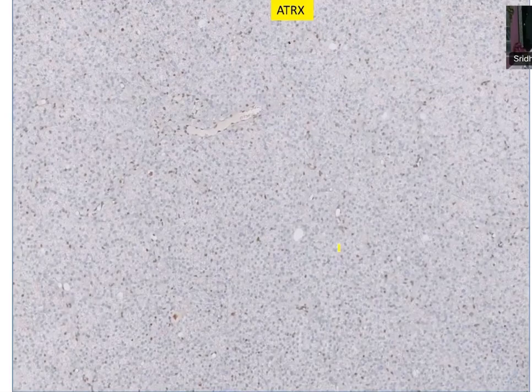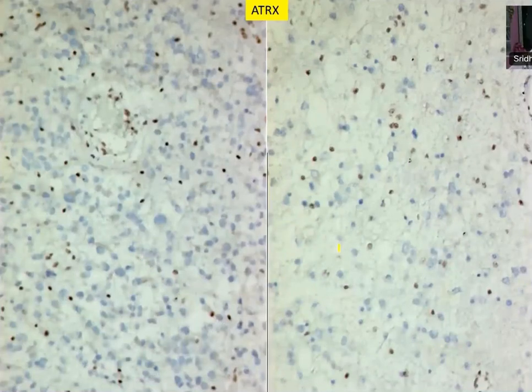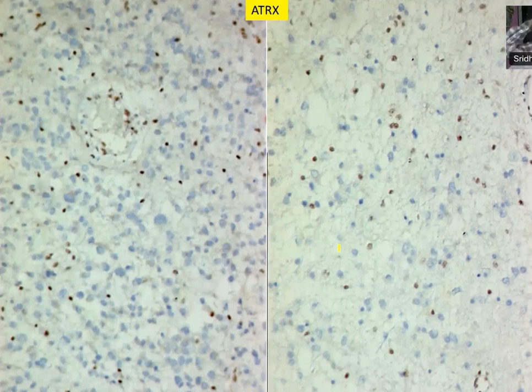How will you interpret ATRX here, Anita? Sir, this is in higher purview, the same thing. So there's loss of expression. I mean, how do you say? Control positivity is seen in the vascular cells. What is this one here? Endothelial cells, sir. So is it lost or retained? That is retained. So this serves you as an internal control. Every native cell should be ATRX retained. Then only will you be able to interpret that IHC for ATRX.